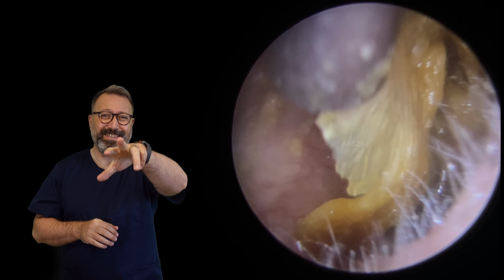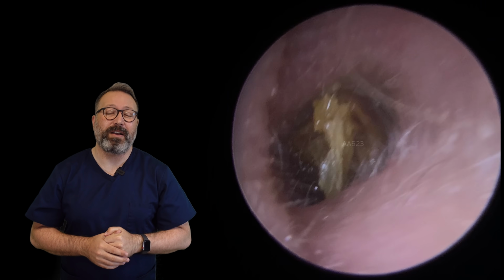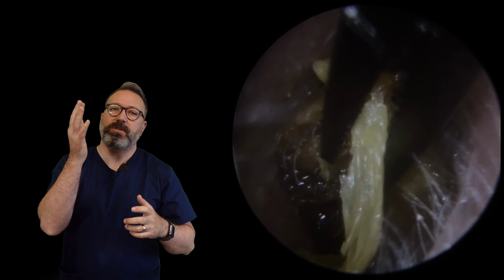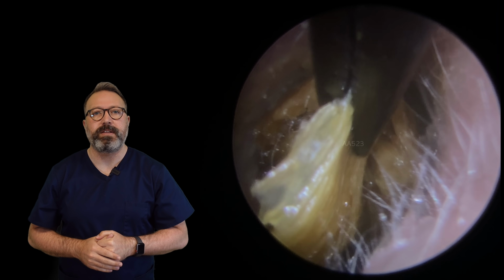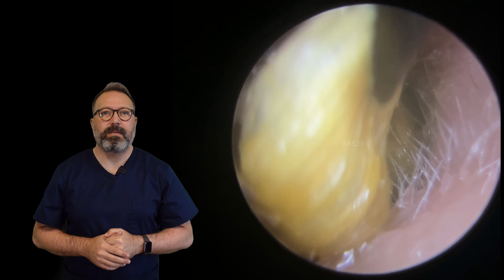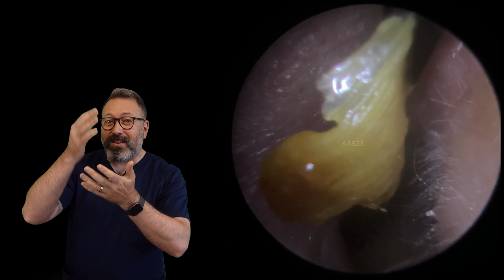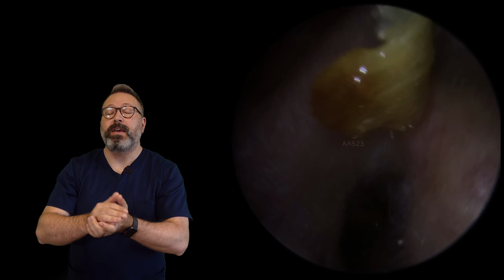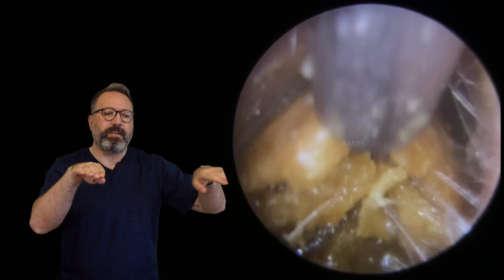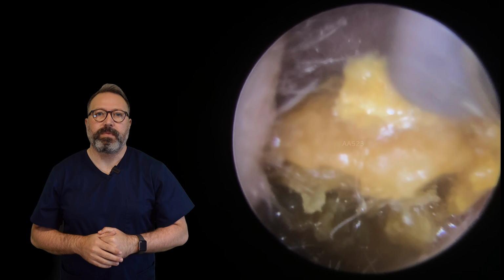Look at that piece of skin coming away there. That was nestled all the way down that right-hand side of that wax. Real big layer. You can tell it's skin because it's got that sort of concertina, that little ripple effect running all the way down. Out that comes. Look at that coming away. Perfect. You can really see that rippled layer running all the way down there. And that's obviously where the skin is migrating out laterally. If you get something blocking at the front, it all kind of backs up and rolls up, if you like. So there we are.